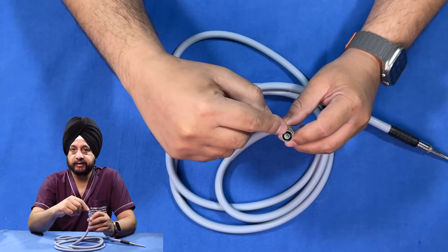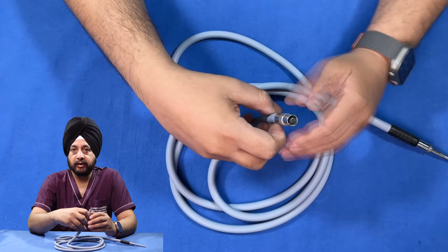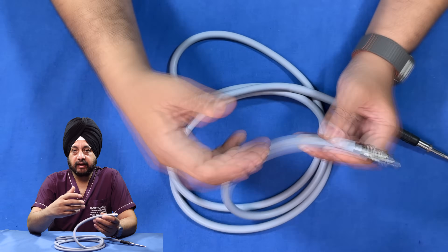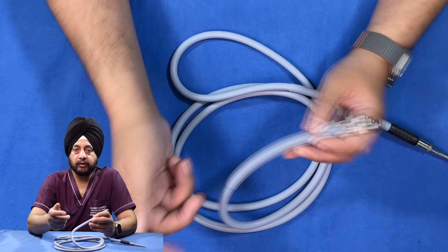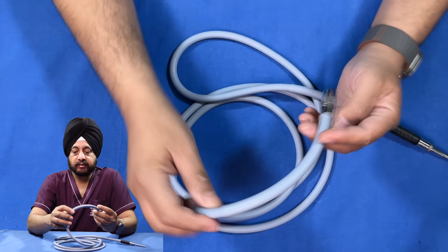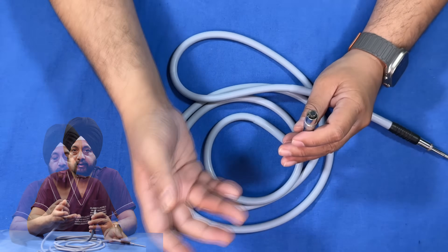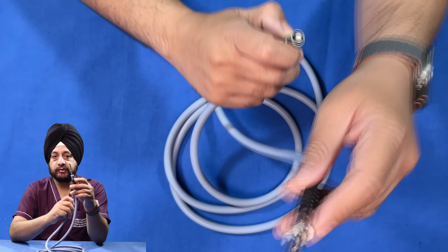The benefit of fiber optic cables is that the loss of light is very minimal and the light is transmitted almost as-is at the distal end. However, the problem is that over time, with the twisting of the cable during surgeries — especially if there is a sharp bend — some of the fibers may break, and there is deterioration of the light quality over a period of time.